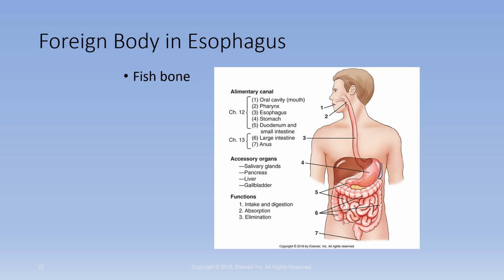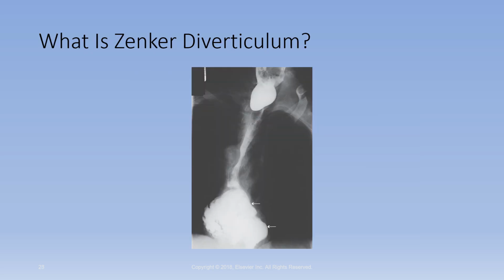Just anything that is radiopaque, that does have the potential for showing up on our x-ray imaging. So they could soak a cotton ball in barium, or like I said, they could use mini marshmallows and soak those in barium.